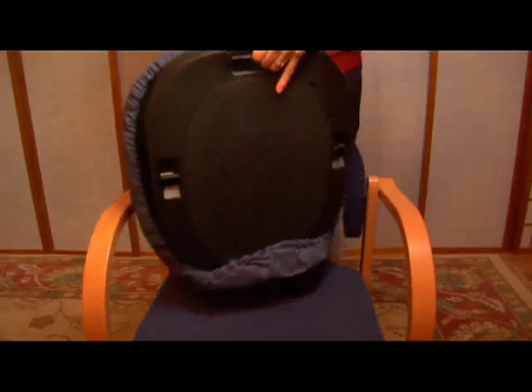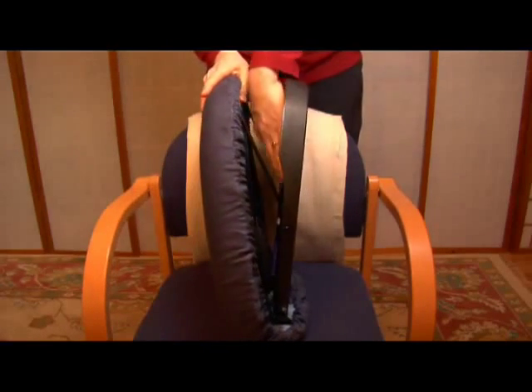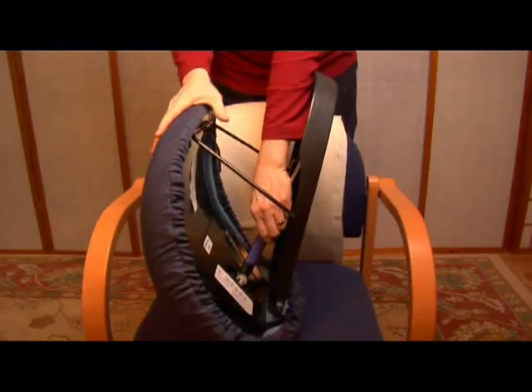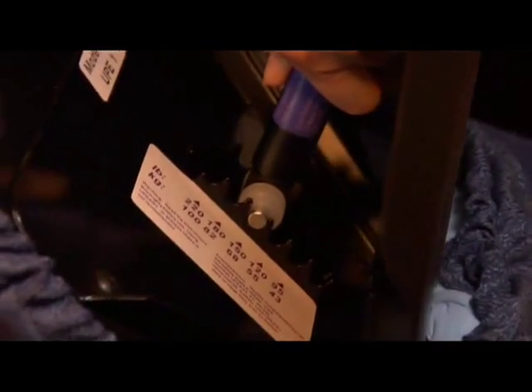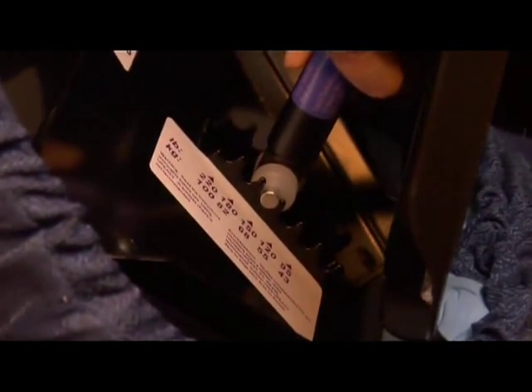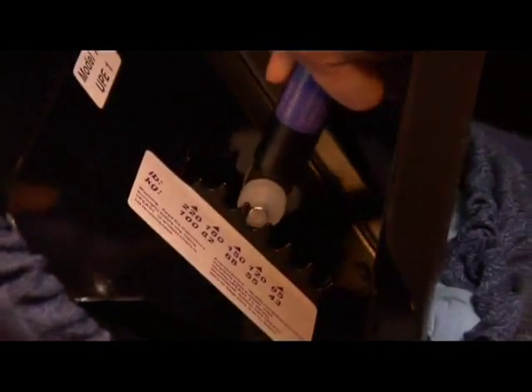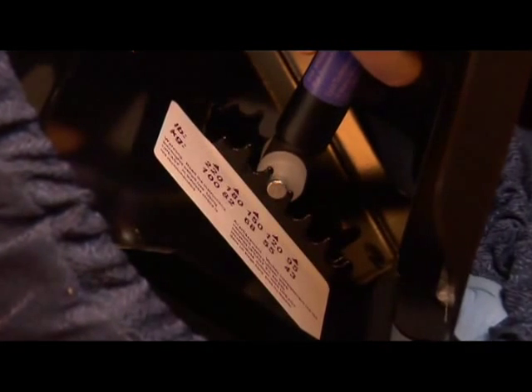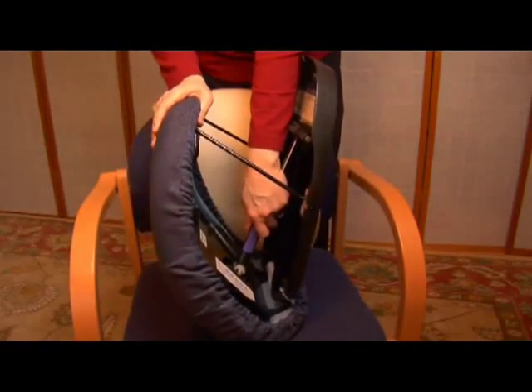To use your Seat Assist, first release the Velcro tab to open the seat cushion. Then you will need to find the proper weight setting for you. To do this, place your Seat Assist on its end like this and push down on the flexible cushion. You will see the lifting mechanism on the inside and various weight settings. Slide the lifting arm into the slot closest to your weight.